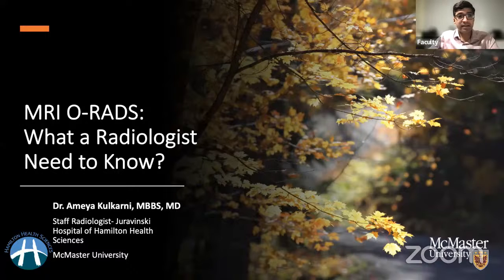I've basically titled it as MRI O-RADS and what a radiologist needs to know. I know that all these American College of Radiology RADS have been an interesting thing to look at. Sometimes it becomes a little bit too obtrusive to your workflow if you're not doing these RADS very often. For example, BI-RADS, PI-RADS, then TI-RADS, then O-RADS. All of these RADS can be a little bit of a challenge. So I just tried to summarize the most important key points which you can take away after today's session.